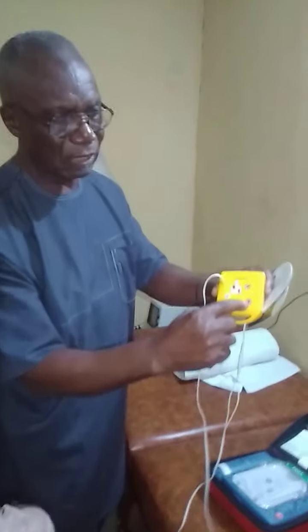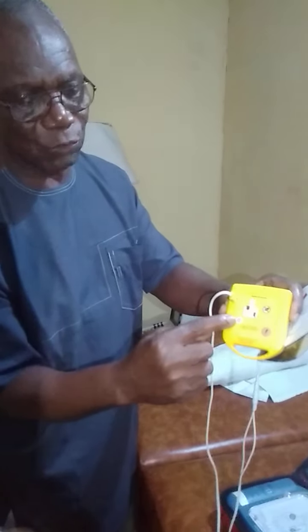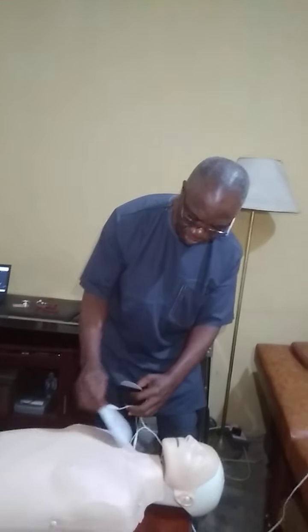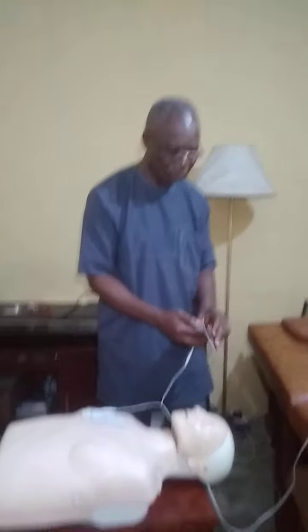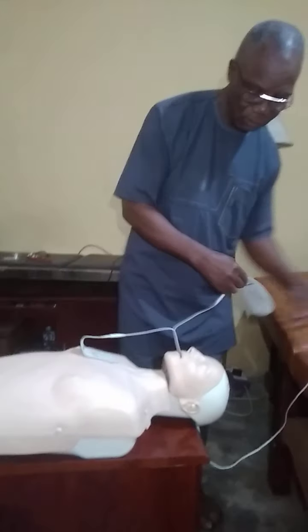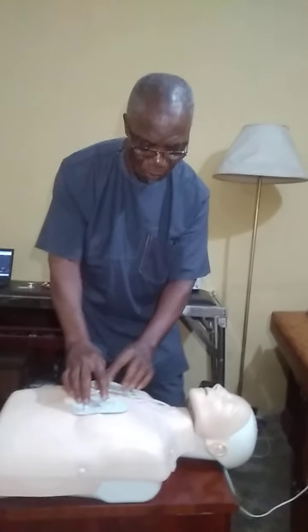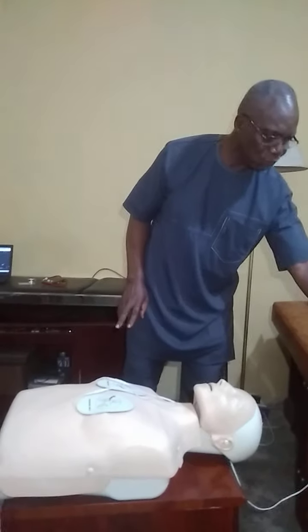I would rather use mine, the one I use for training, which is the same thing. It also has the orange button, and then of course this one is indicative of the green button. Okay, so this is what I'm going to use. Now remember what it said, AED, how it's applied. First of all, it says peel out this, and apply one on one side of the chest and the other one on the other side of the chest, a bit lower. Okay? Once it's been applied, I'm going to use that.